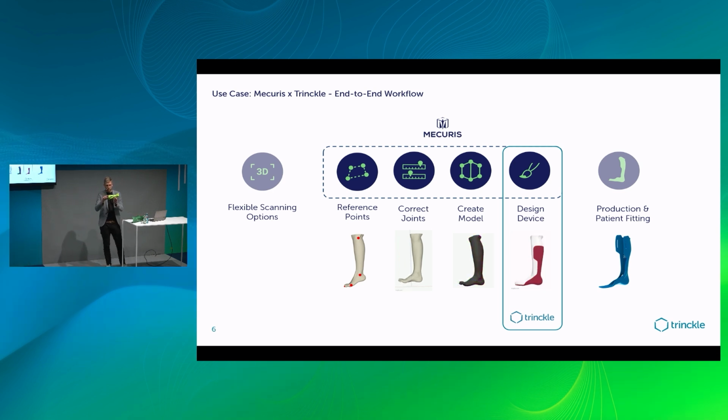After he's set this trim line, the next things would be adding components like strap holders here to attach a strap, or for instance, set this perforation for a better ventilation of the part, for more comfort for the user. Again, here on this one, you see strap holders, for instance, perforations.